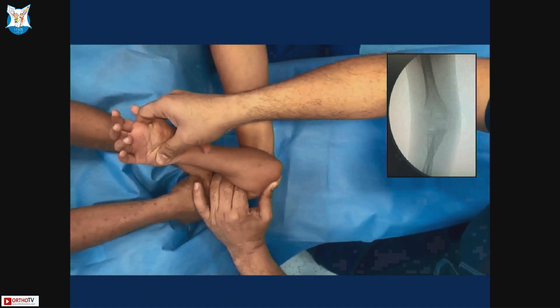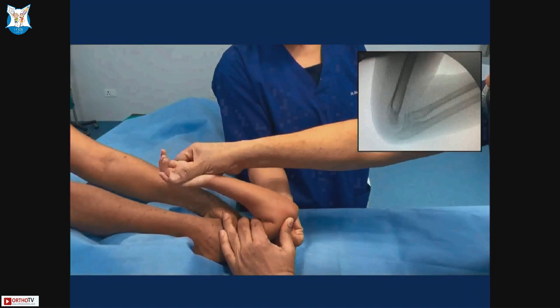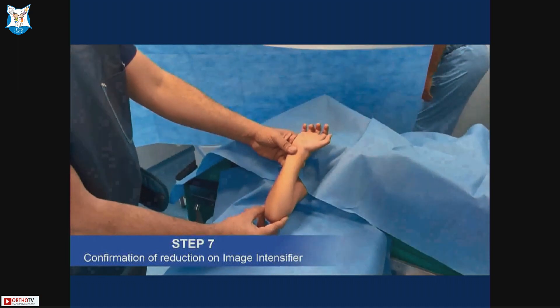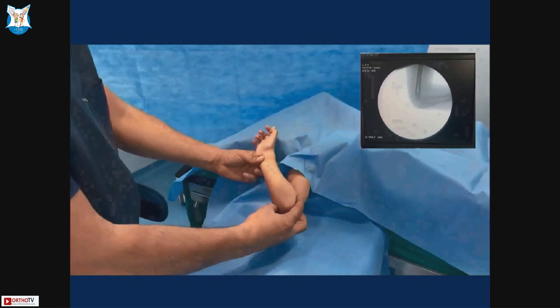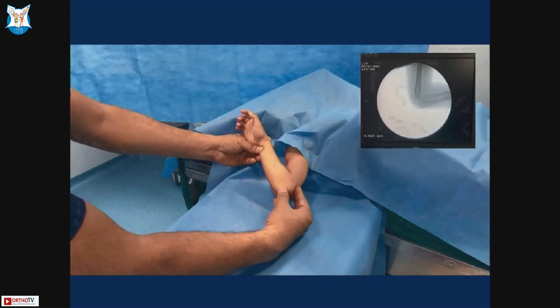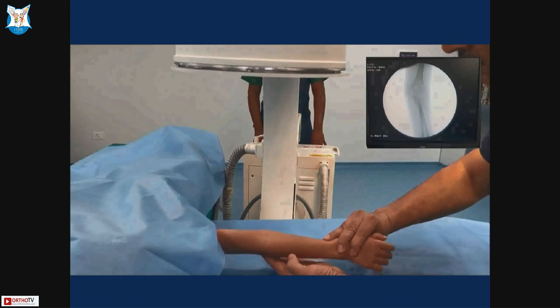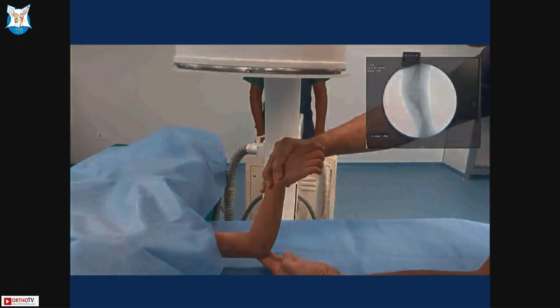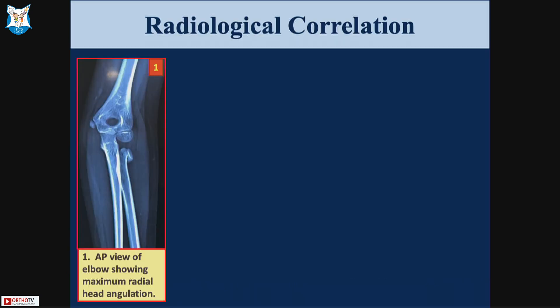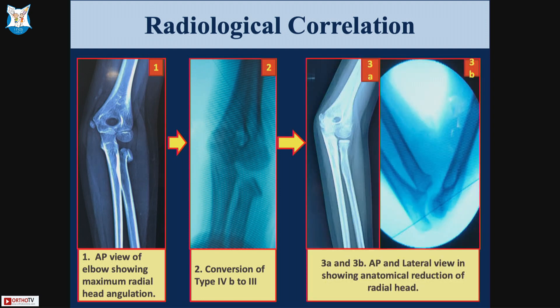With this maneuver, you will see the radial head reduce. Once anatomic reduction is achieved, check stability through full range of flexion-extension and pronosupination in both lateral and AP views. If the radial head is stable, you do not need a K-wire or any implant — just immobilize in pronation. Apply a plaster in pronation. As seen in the radiologic correlation, the type 4 converted to type 3 with traction and thumb pressure, and then completely reduced with the maneuver.